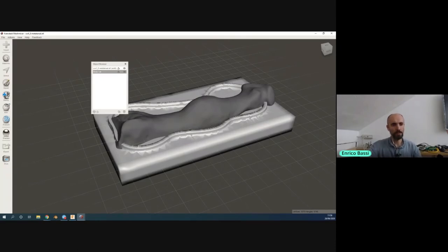But basically, you get the two pieces together, and then you just merge them. Okay, this is the mold you want to get. So you have to cut off, of course, the box the same way you did it with the scarf. You can do it here, and you can do it in Fusion. It's up to you.